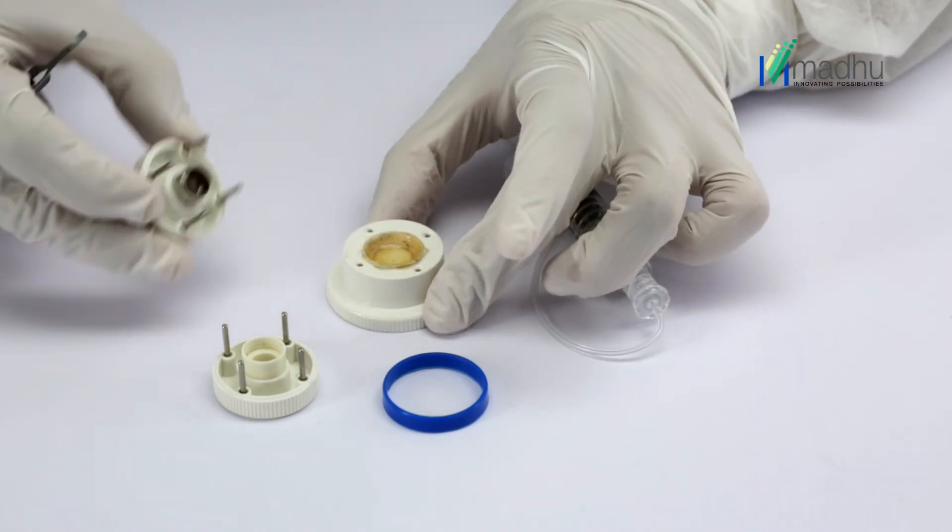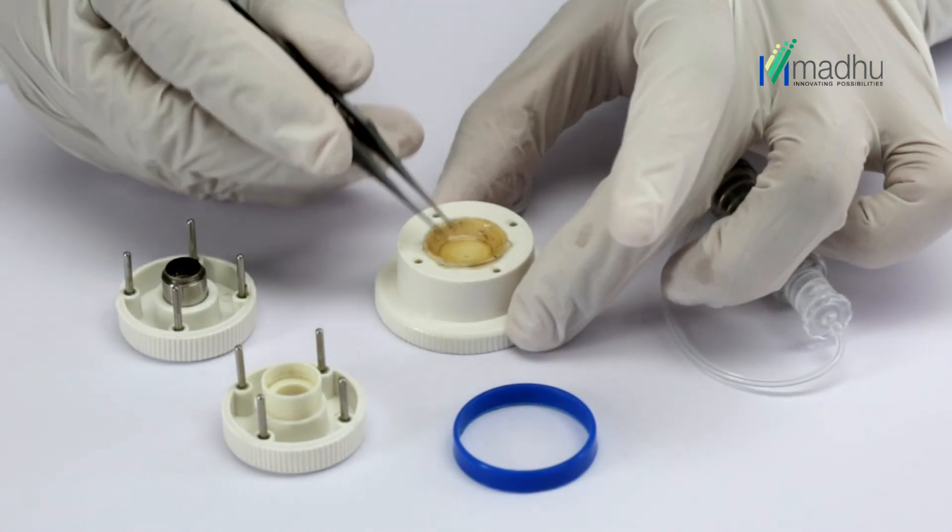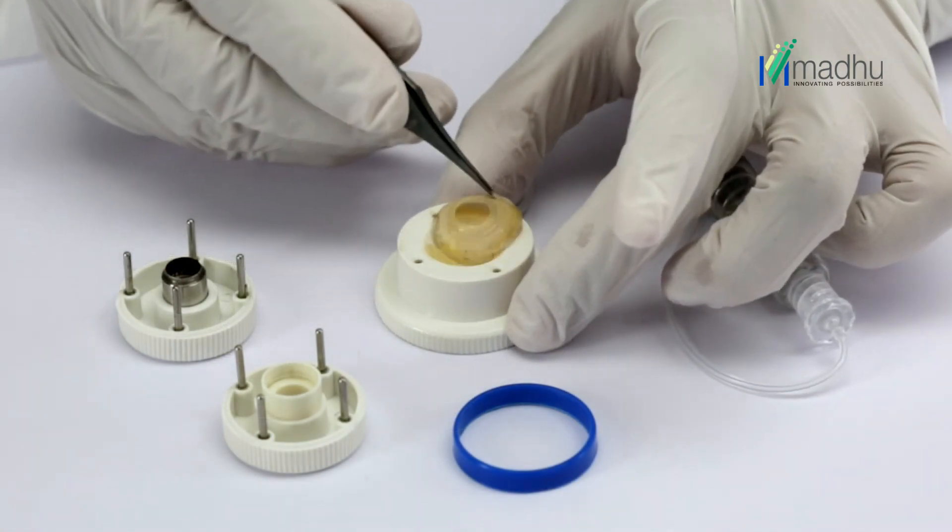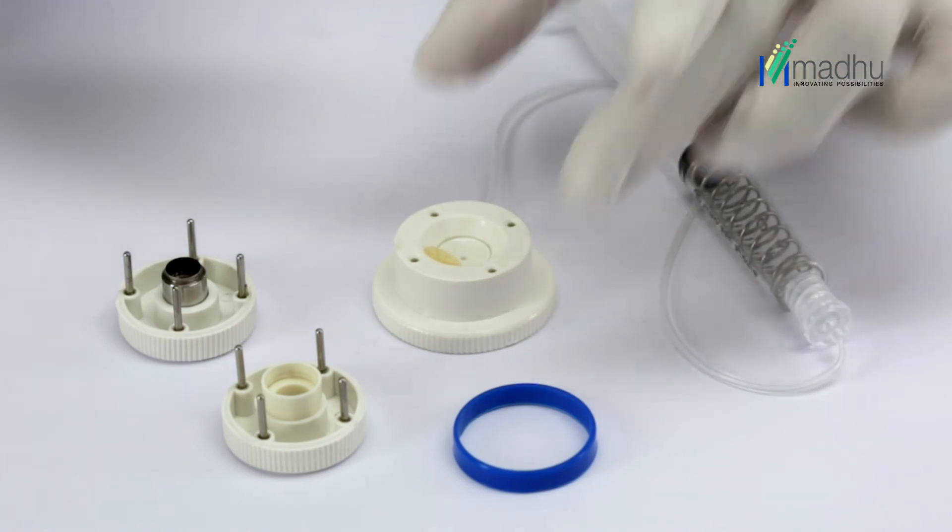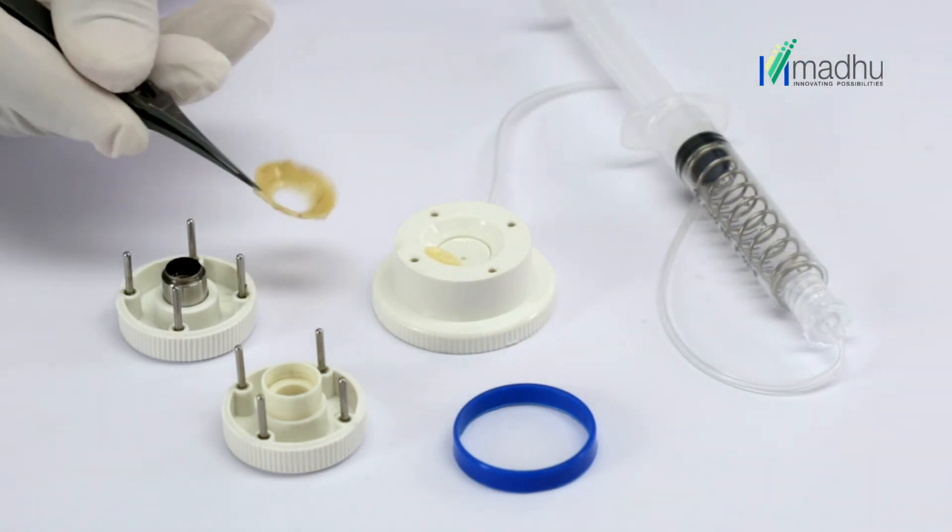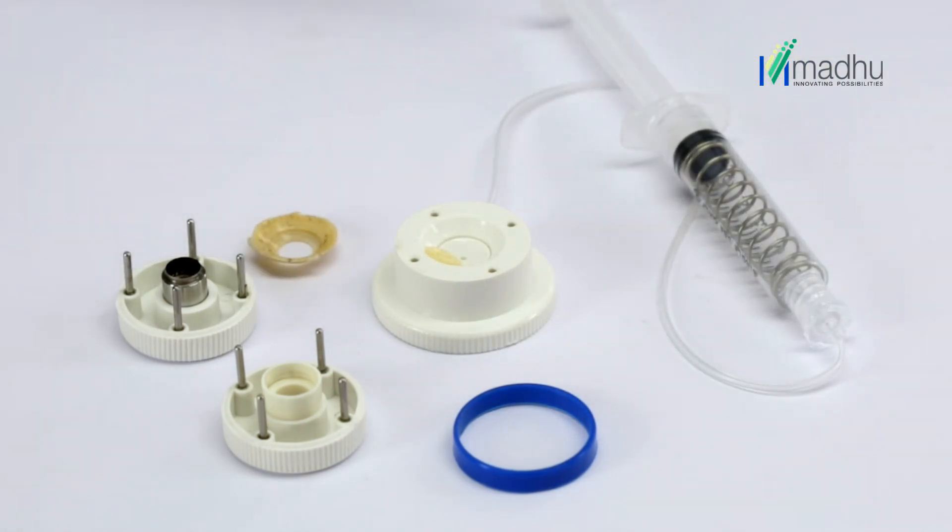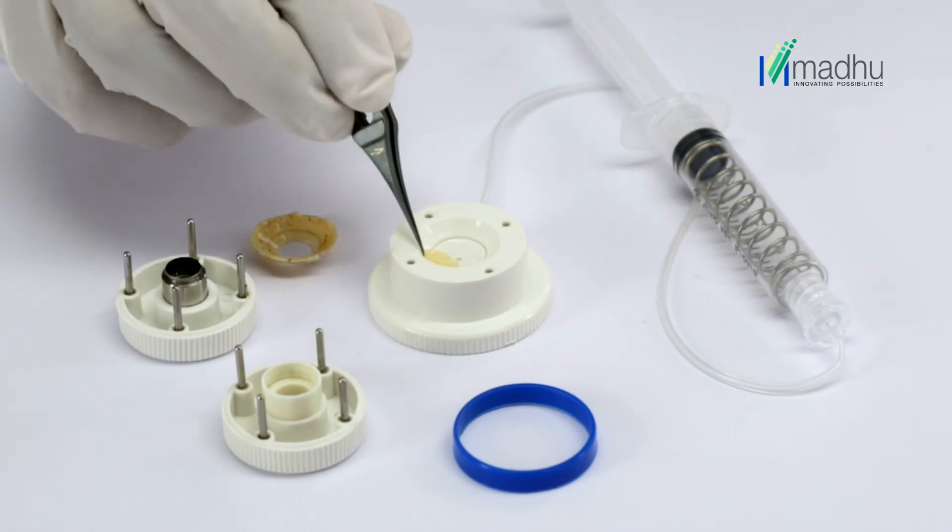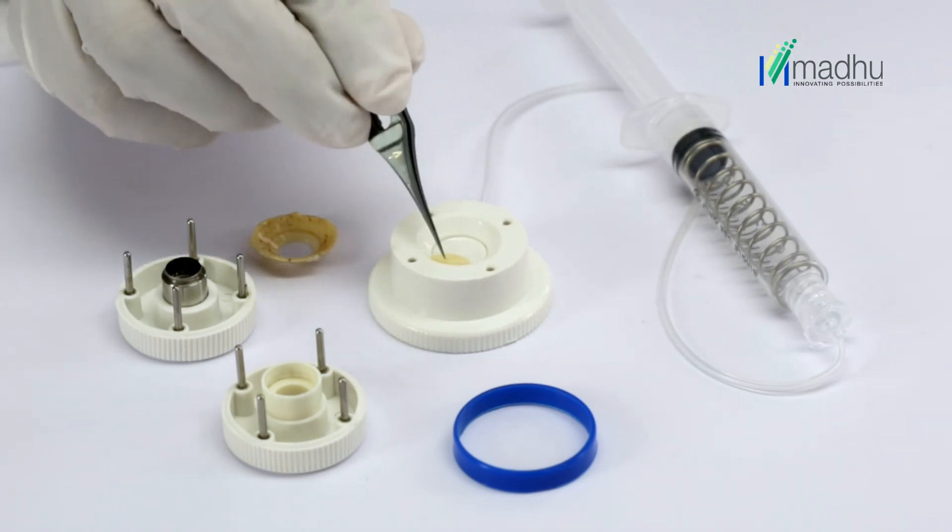Grasp the scleral rim with a fine-toothed forceps and remove the rim. This releases the vacuum and leaves the donor cornea button in the well of the cutting block base. A donor corneal button of the desired diameter is ready for use.